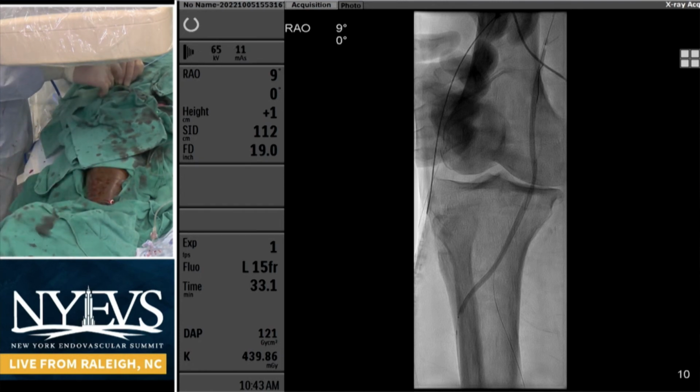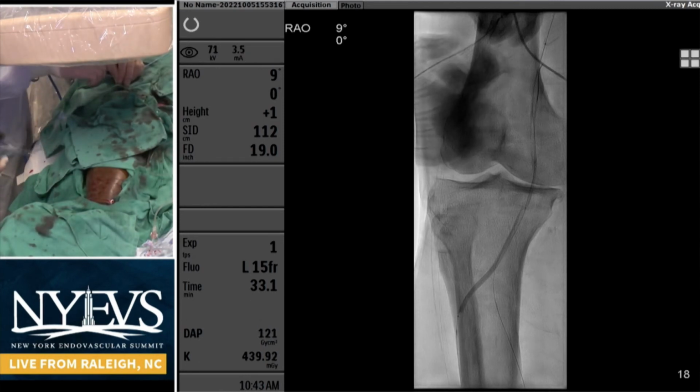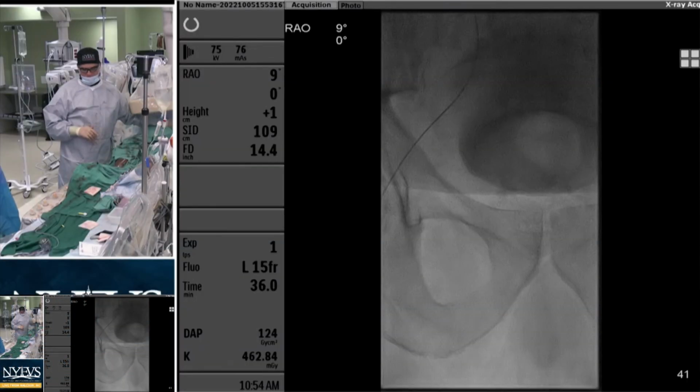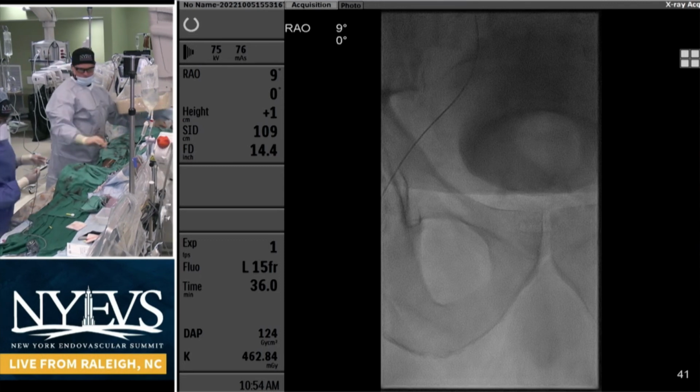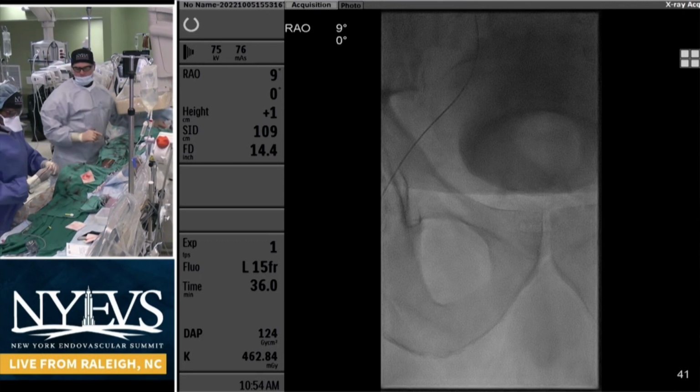So I think we all agree with your thought process. We'll let you balloon the lesions, get some luminal gain, and get some pictures, and we'll have the last talk. So we'll go one final time back to North Carolina to see where we stand. We see the AT results were looking good, but let George take over. Both of these wires on it.